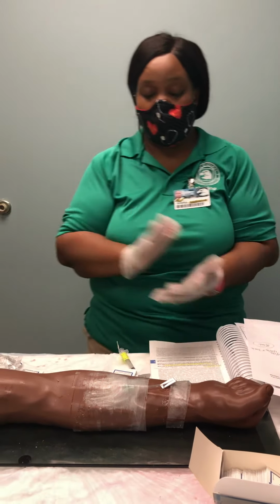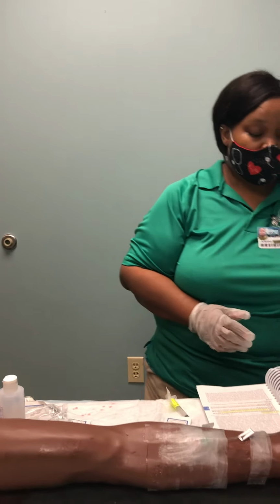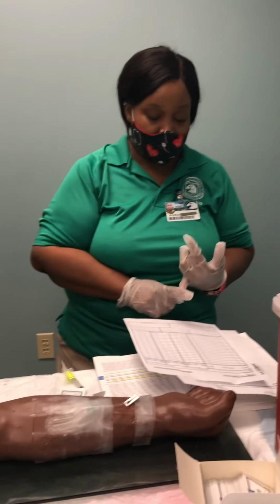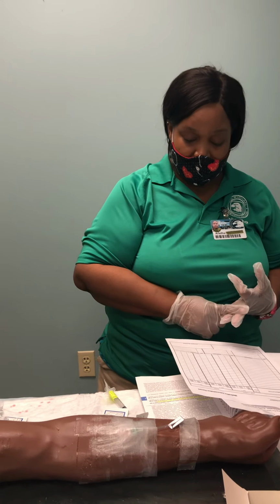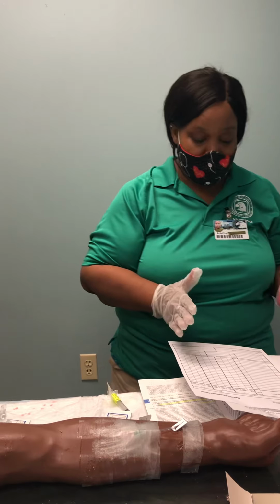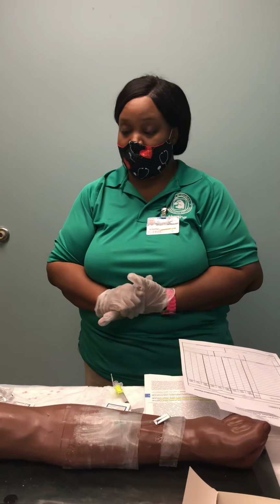And I'll give it in the push-pause method. This medication was stat. So I will chart on the MAR the medication, how the patient tolerated it, the route of the medication, which was IV push, Zofran, 2 milliliters over 5 minutes, the time, and I will sign my name, because that will be my documentation.